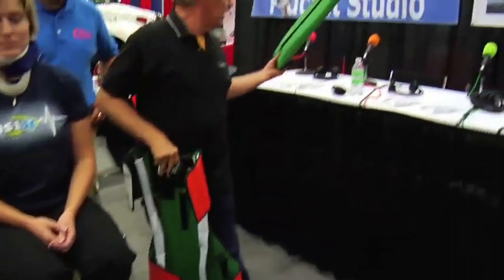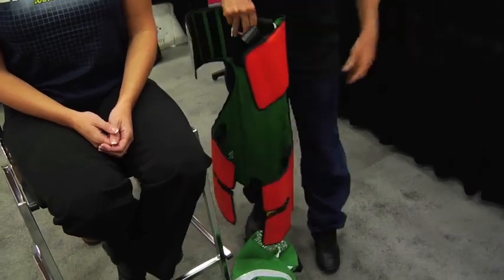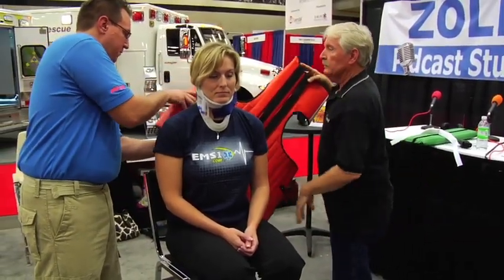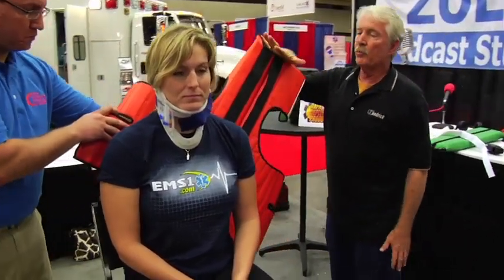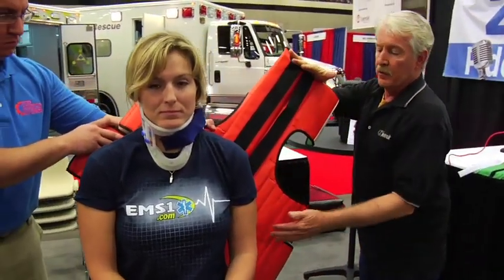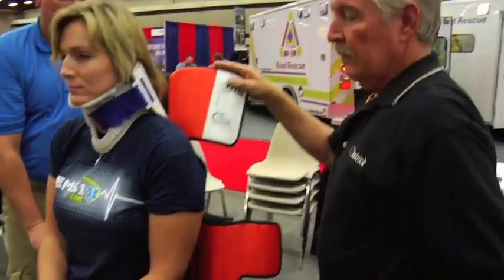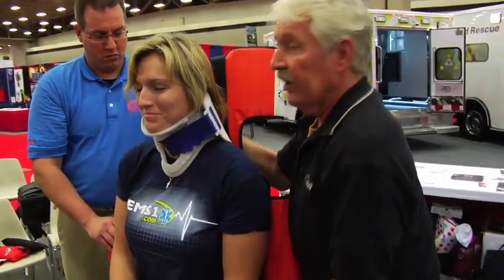Take the piece parts out. We're ready to pass behind the patient — we're assuming that she was driving the vehicle. At about a 45-degree angle, you press down on the structure to pass it in behind her back. You reach in and make sure that it doesn't catch up on her belt. Extract her wallet, check for ID, and then you upright it once you're through the door.